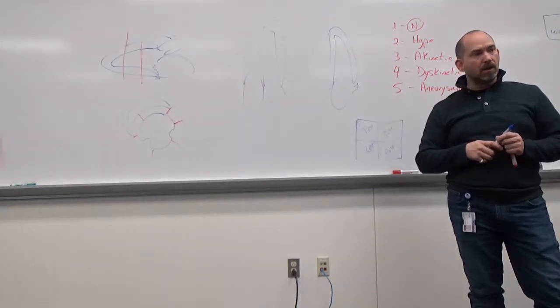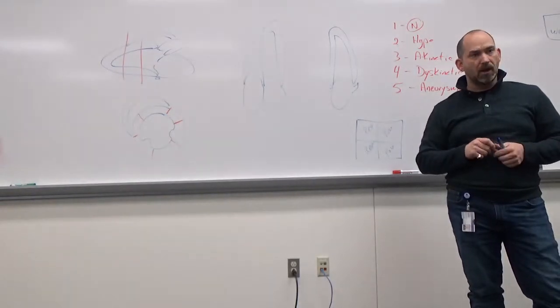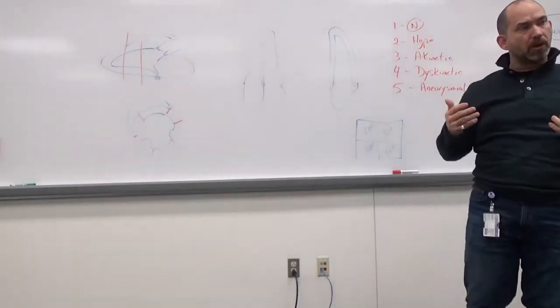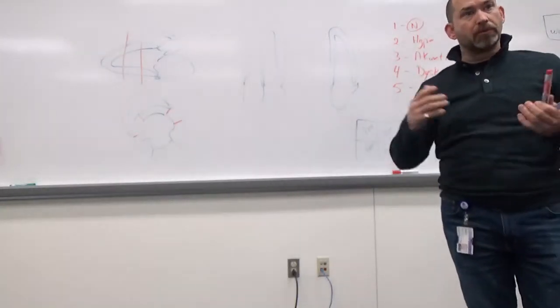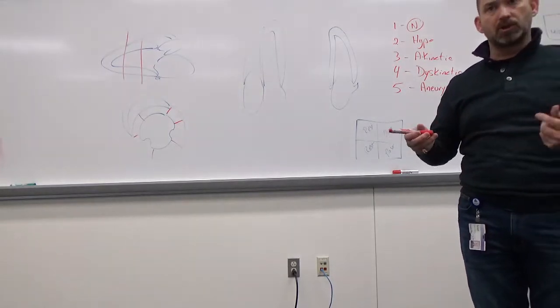So it reduces the heart rate, right? It doesn't allow the heart rate to get up. So the point of doing a stress echo is that we push it so that the heart rate increases. And if we're fighting against a medication that's counteracting that action, we're not going to get a good test result.